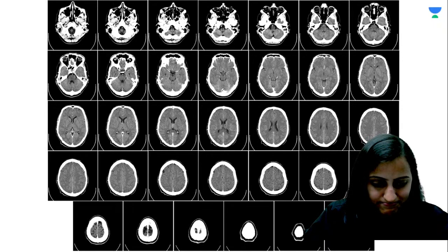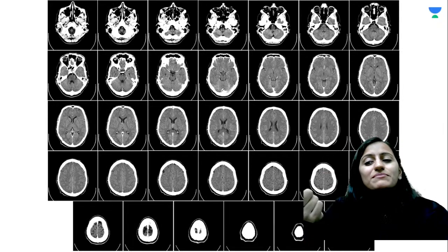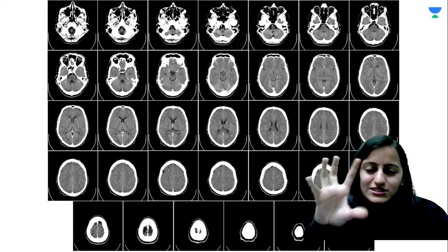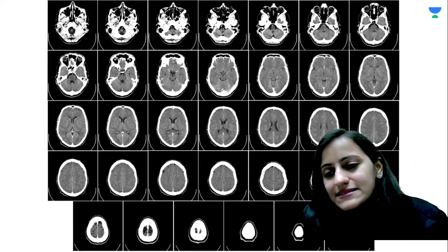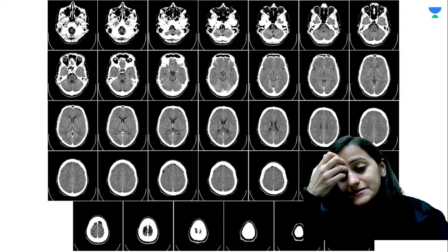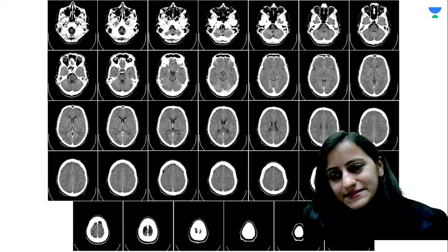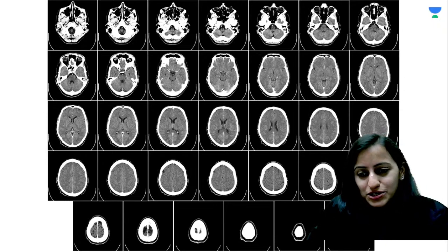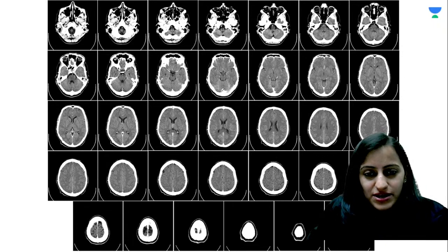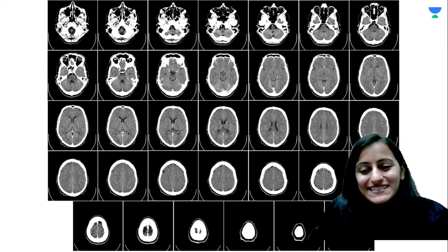Okay. So first of all, identify whether this is a CT, because this is how the images are in real life. It's not just one image, you get the entire film. Is it a CT? Is it an MRI? What do you think this is? It's a CT. Is it contrast or is it non-contrast? What do you think? Good, very good. All of you say it's a CT, but is it contrast or non-contrast?